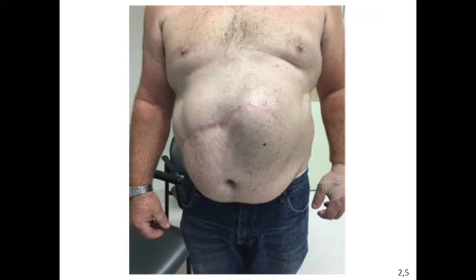Shown here is a large incisional hernia just left of the midline that could be amenable to a left-sided TAP block.